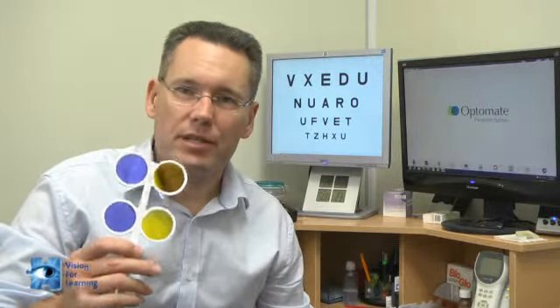Thirdly, the blue and the yellow tinted lenses used in this screening are based on the Kodak Wratten filters, number 15 and 47B. These are the ones that are used by the Dyslexia Research Trust in their controlled trials.